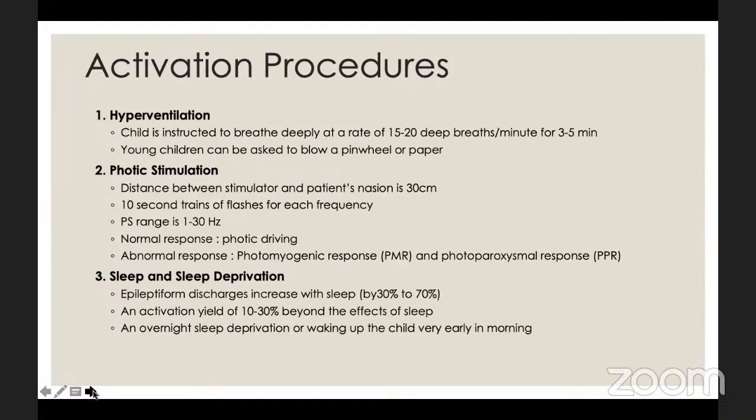So what are the activation procedures? As Madam Kalpana Datta was referring, consider what you should write while asking for an EEG to be done. Apart from sleep and awake, there are certain activation procedures. Sleep itself is an activation procedure that can be asked for in an EEG. So you can have hyperventilation, photic stimulation, sleep and sleep-deprived EEG.